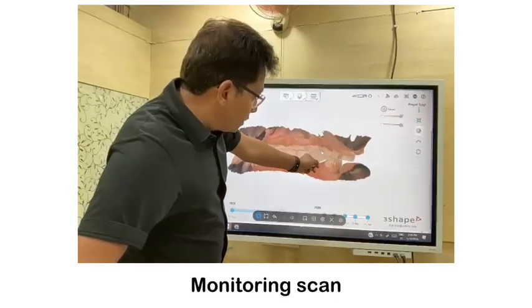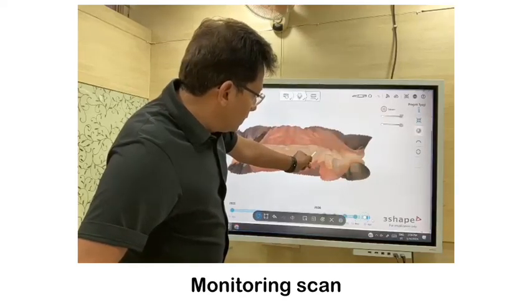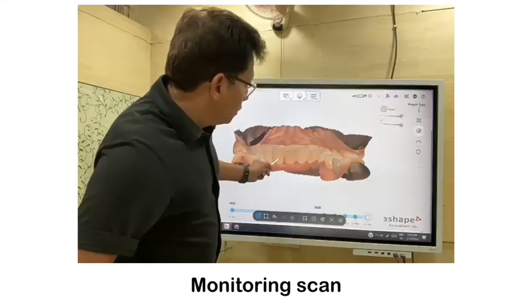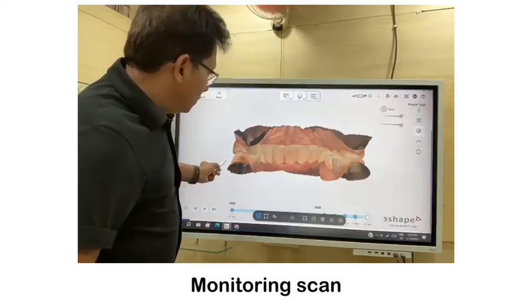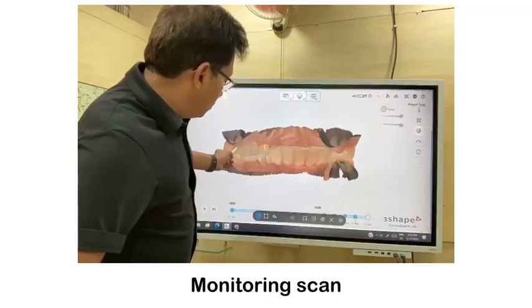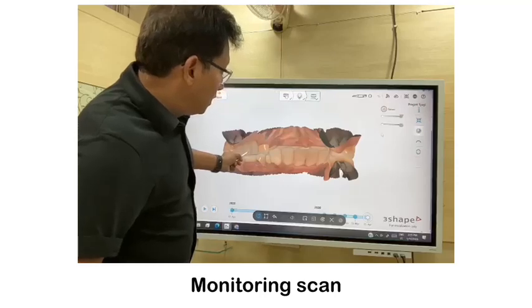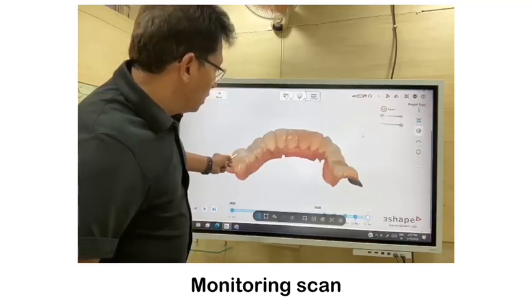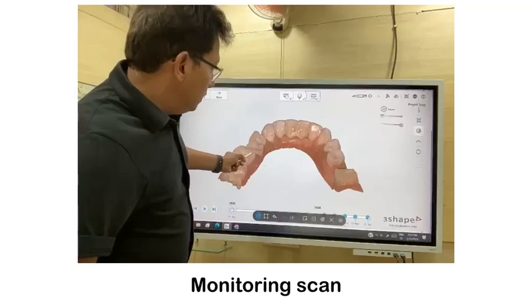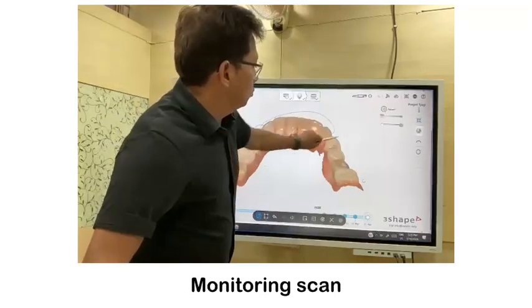Each and every tooth is rebuilt, and we have created the guidance. Now I'll show you, this is the original, and this is the final. If you see, this is the original and this is the final. I'll show you on the lower. This is the original and this is the final. So these two are composite. Each tooth is a composite build up.